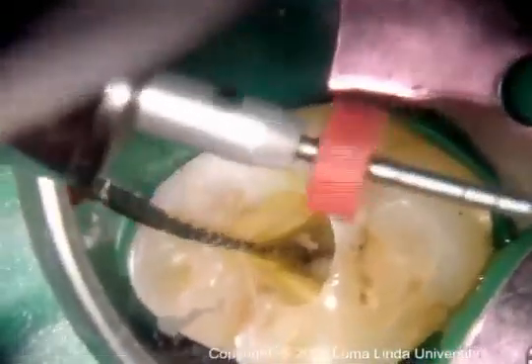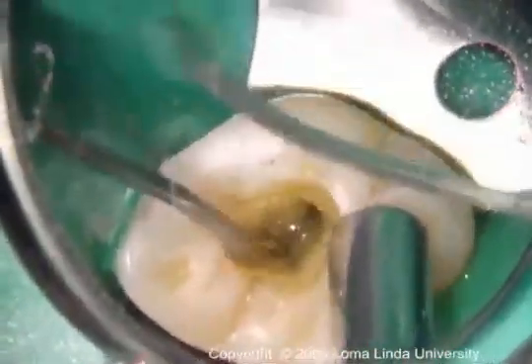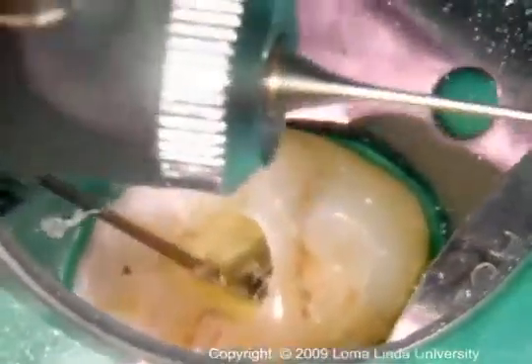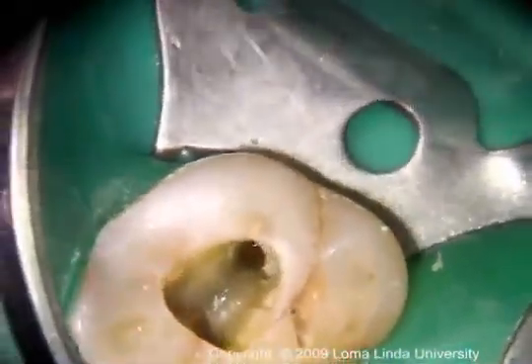The coronal portion of each canal is flared with rotary instruments to establish straight line access to each root. Sodium hypochlorite is used to remove the generated debris. Gates Glidden burrs are used to establish straight line access to each canal. The canals are now ready for cleaning and shaping.